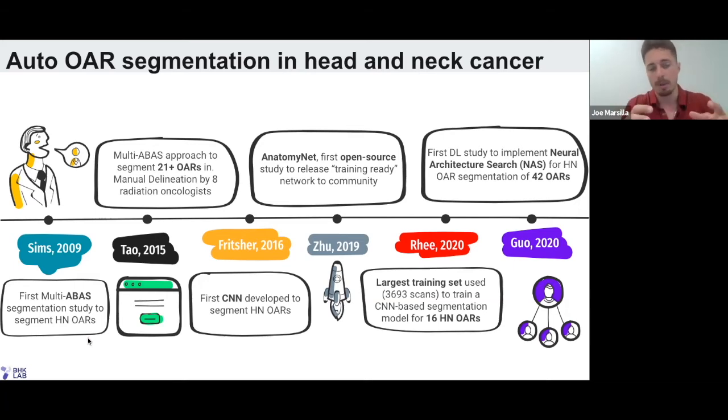There was a collection of patients used to make a general image consensus that new contours would be deformed to. Now, in the 2015-2016 era, with the advent of UNet, that was replaced by convolutional neural networks, which a lot of you know about because that's what you specialize in.